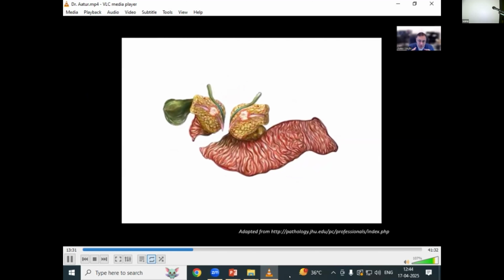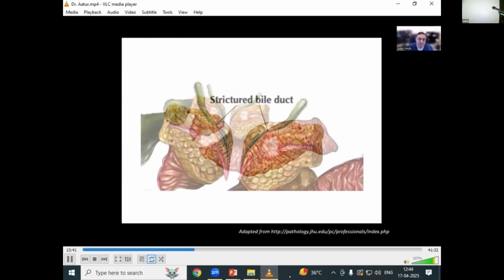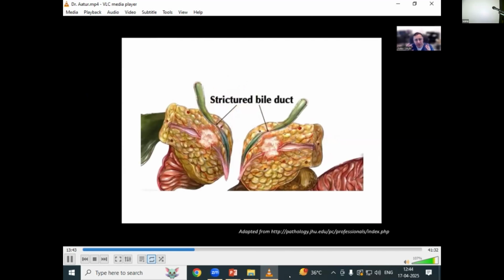opening the specimen, giving that pathologist the idea of where that mass lesion is with respect to all the anatomic landmarks while all the frozen sections are being done. In other words, are we dealing with a neoplasm arising from the pancreas, bile duct, ampulla, or small intestines, and its proximity with respect to the margins that have been taken for frozen section? It certainly lets me sleep a little better at night calling a margin negative if I know that the tumor is grossly far away from those margins.